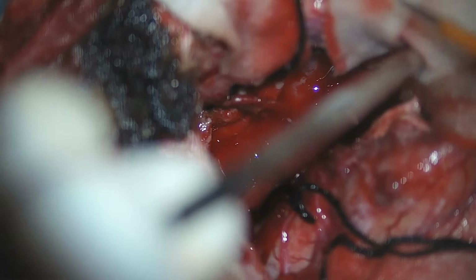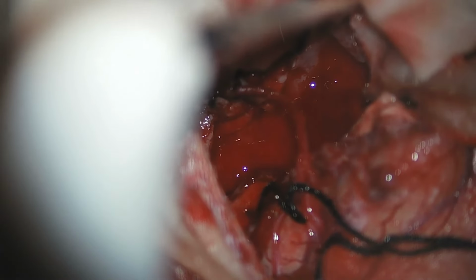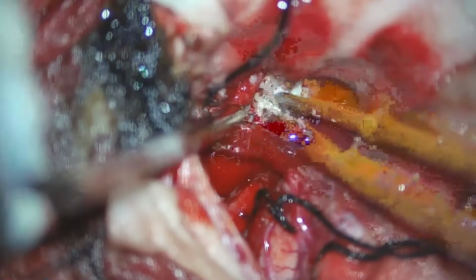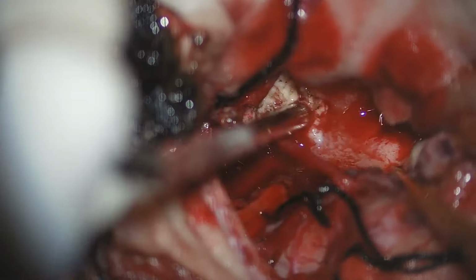After getting a good normal brain margin, we use the cotton patties to pack the area and continue debulking the tumor. We preserve the normal brain and we continue debulking the tumor.